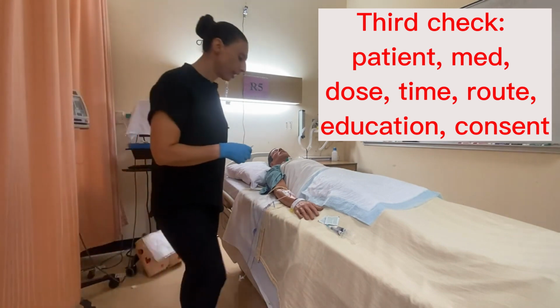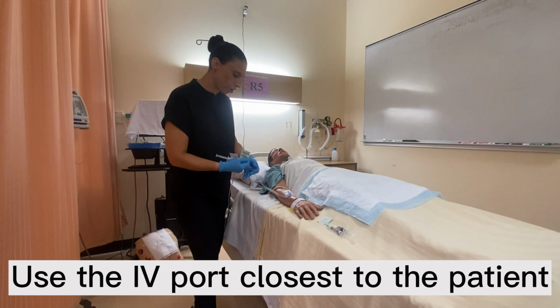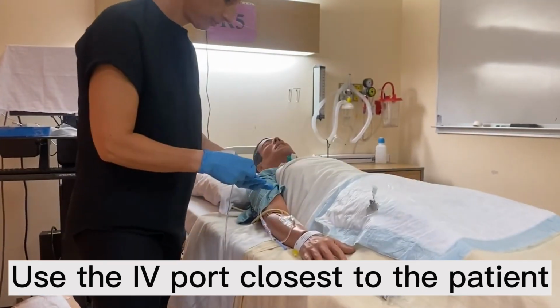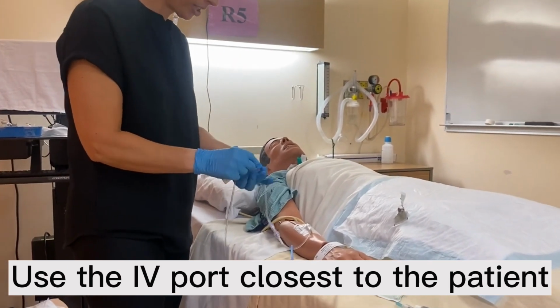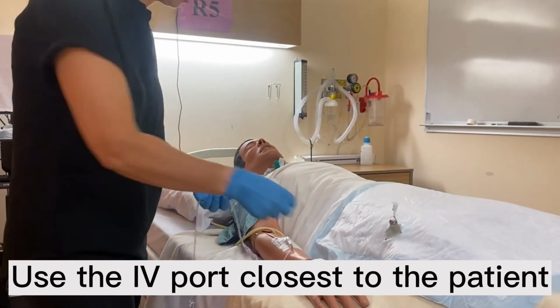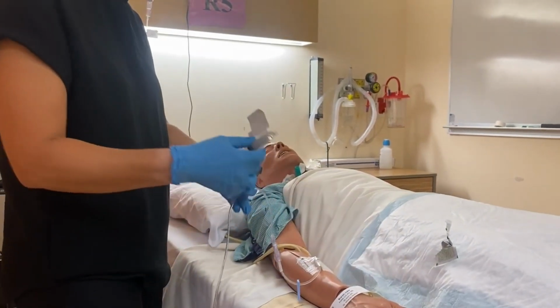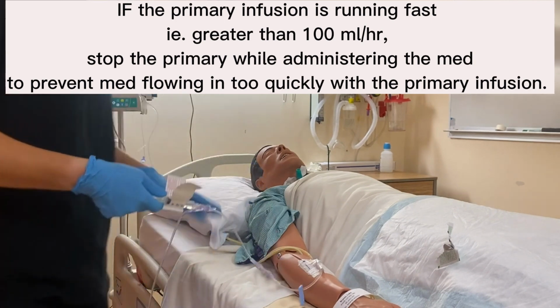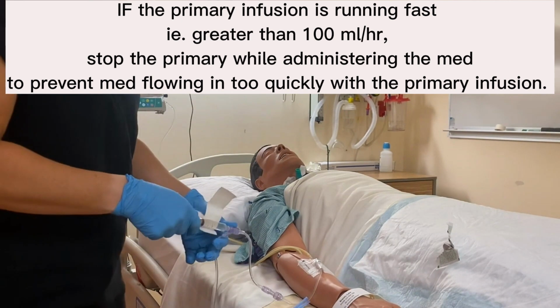I'm in pain. So what I'm going to do is choose the port closest to the patient. I'm going to swab that port, 30 seconds, dry for 15. Attach that syringe, okay? And you can leave your primary infusion running. That's okay.